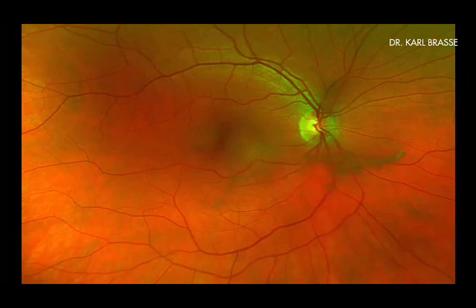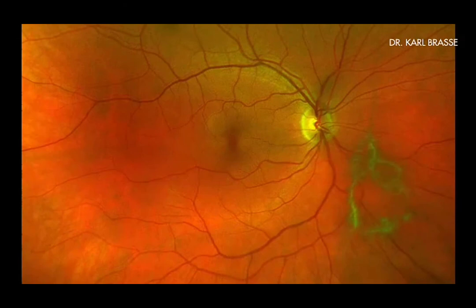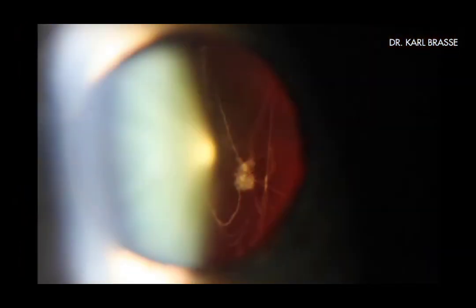Removing it gave the patient a high degree of satisfaction, but just for a few days. These 3 follow-up scans within a few weeks reveal the reformation of a large bottle brush floater in the periphery. YAG laser vitreolysis partially vaporized the floater material, but a huge part of it is just fragmented into numerous little pieces of collagen fibrils which unfortunately show the tendency to form new clumps like you have seen it in this case. To avoid this scenario of reforming clumps, I have successfully treated in this case just the little floater cloud and left the cobweb of floater strings.